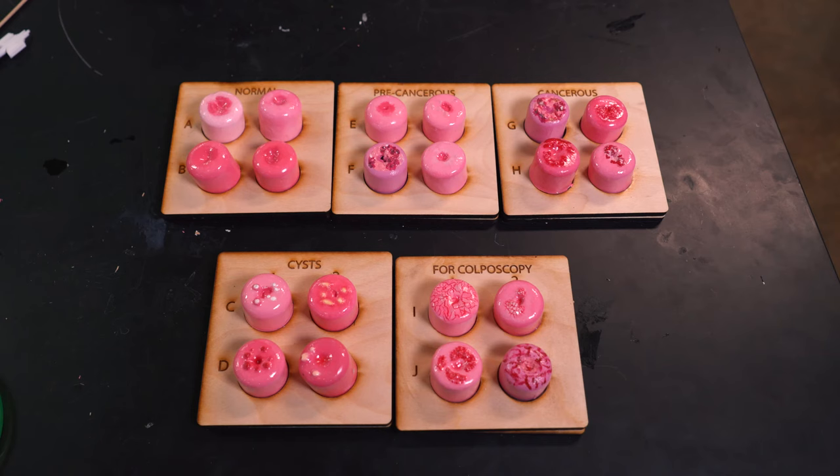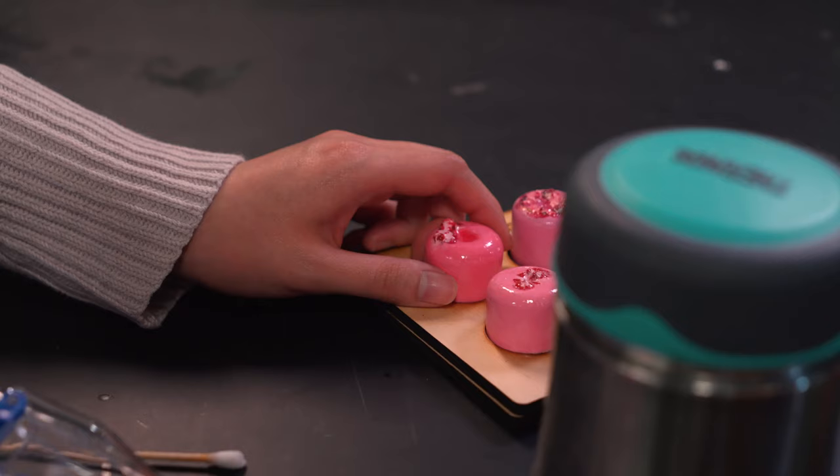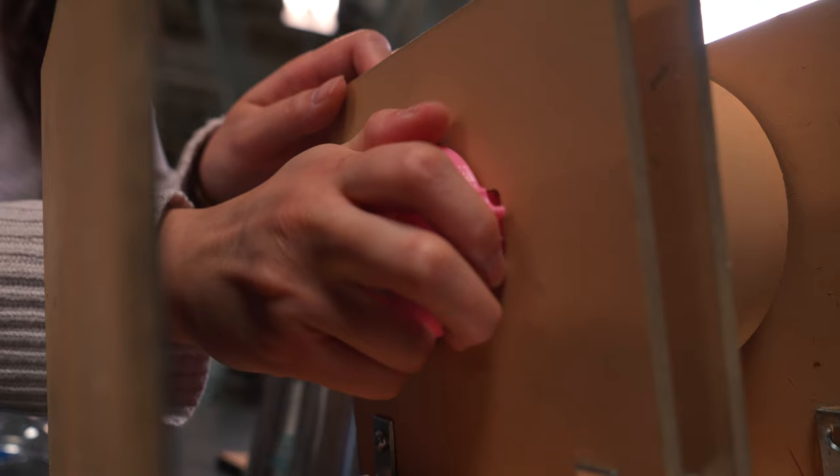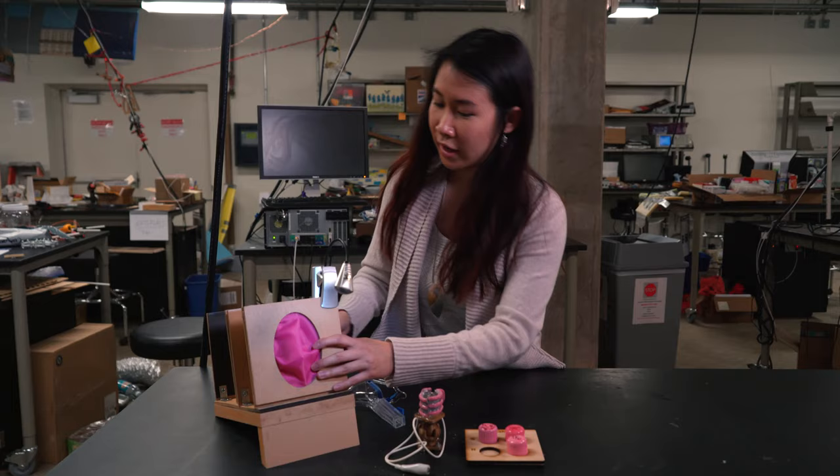in order to screen and provide prevention services for the entire population. All of these different cervixes can fit into these model holders — this clips into the back of the model right here — and then you take the speculum.